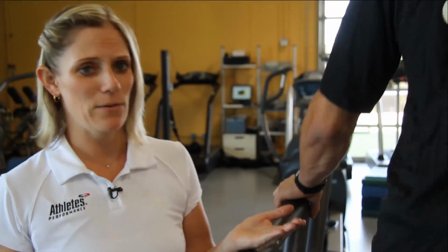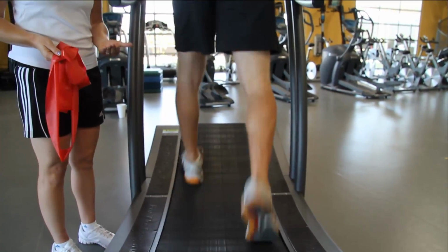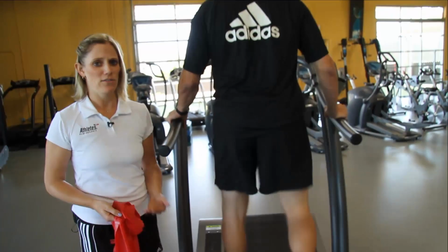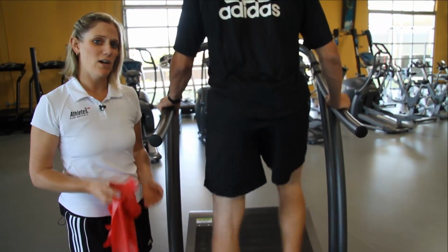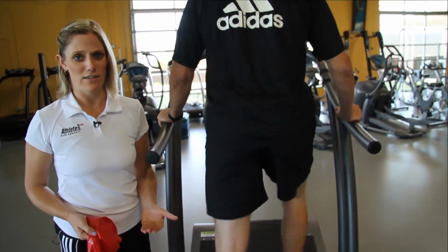So as we look at Matt, we can see that he has a little bit wider base of support, and he tends to almost waddle or laterally tilt his pelvis over each leg instead of laterally translating his pelvis in a horizontal manner over that leg with single leg stability. So we're going to identify that Matt has a right limb dysfunction where he is not translating his pelvis laterally over his right femur when he's weight bearing in that closed chain single leg stance.